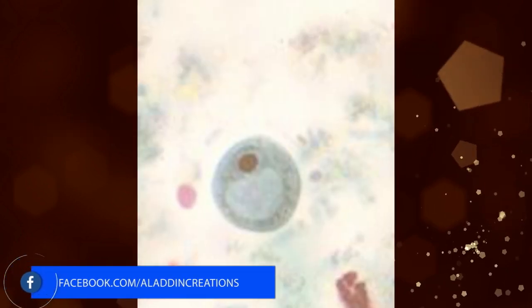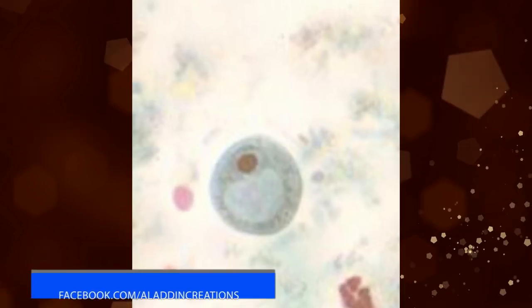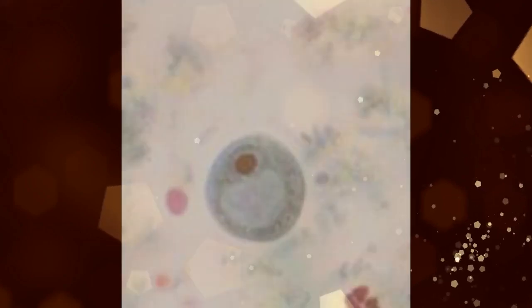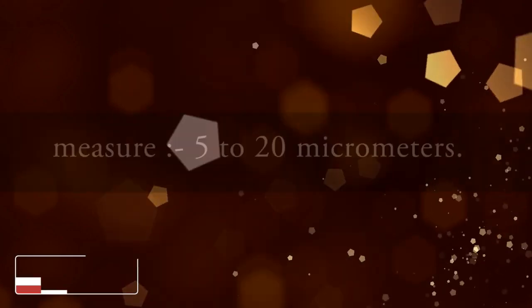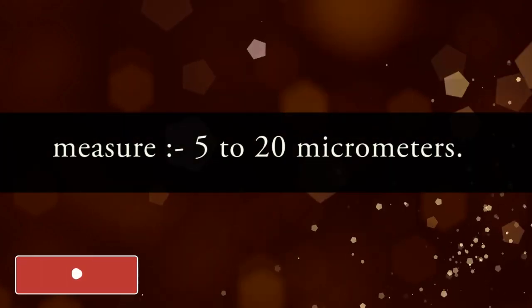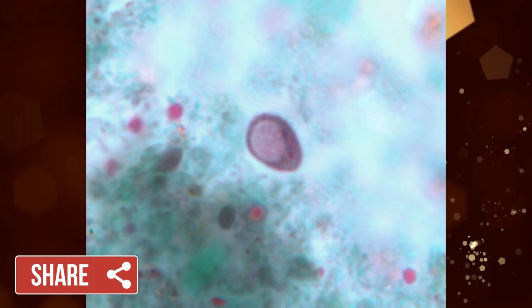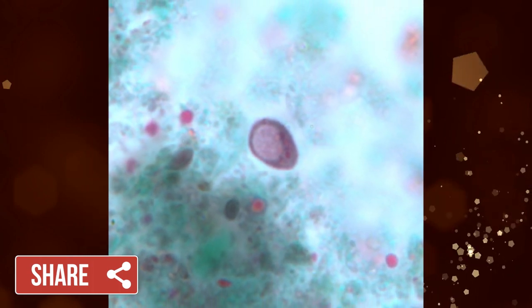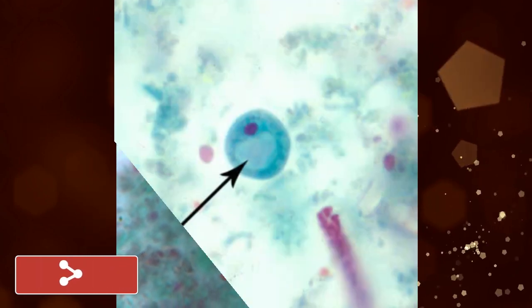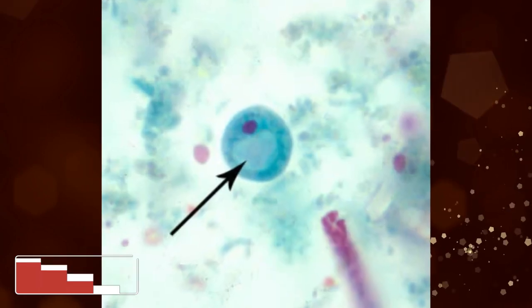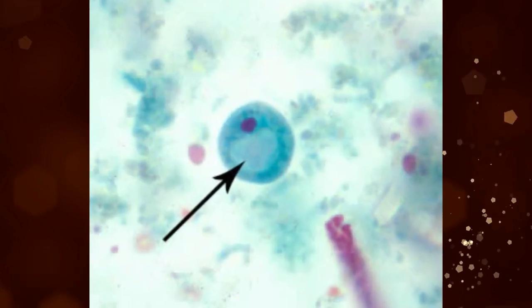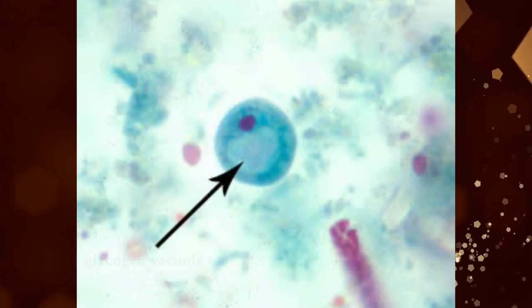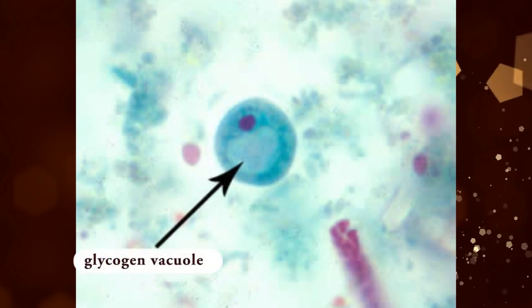Cysts of Iodamoeba butchlyii vary from being nearly spherical to ellipsoidal, and measure 5 to 20 micrometers. An important diagnostic feature for this species is the presence of a large compact mass vacuole of glycogen in the cyst stage.